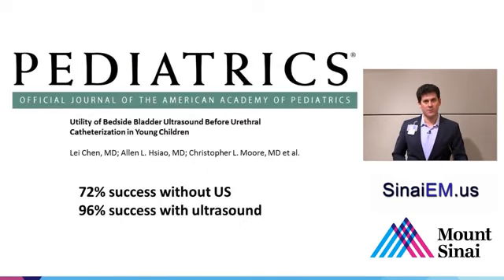There's some literature on using bladder volume for something very straightforward like procedures. Now, you may be thinking of bladder catheterization in terms of a suprapubic aspiration, and that's certainly possible. It's becoming, I think, a bit more of a rare procedure that's needed at this point, or at least just to be able to get urine where you couldn't otherwise get it. But urine catheterization can be aided by ultrasound guidance, mainly by making sure that you don't have a dry tap.